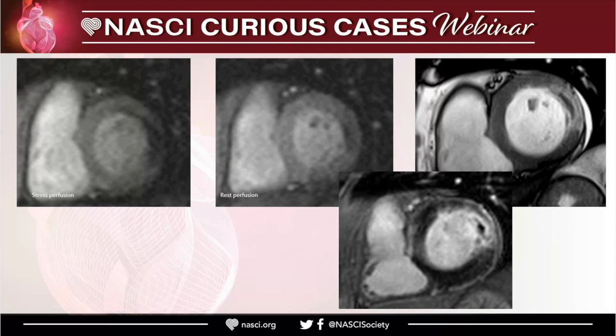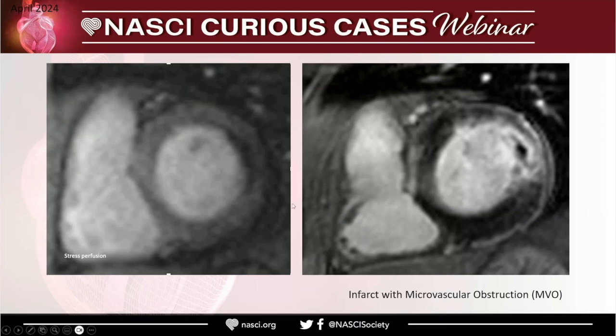Yeah. So how do you do it, Mohammed, in your place? Just stress, only stress. We are not doing rest perfusion anymore. Okay, so you compare the stress with the delayed enhancement like here. Yeah, stress and late enhancement.